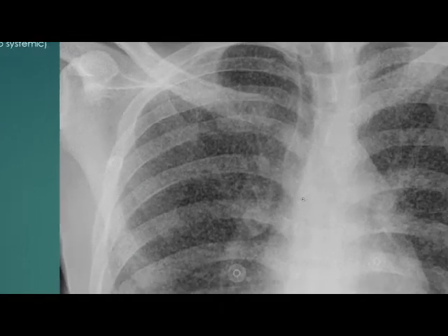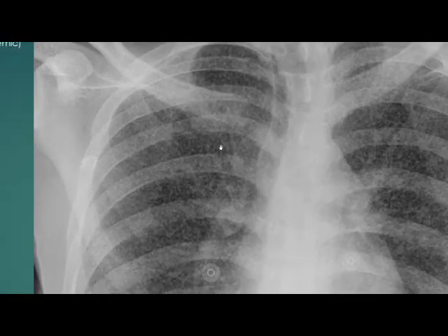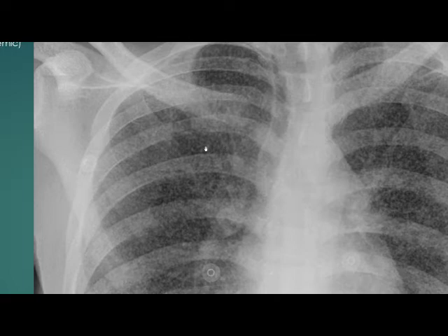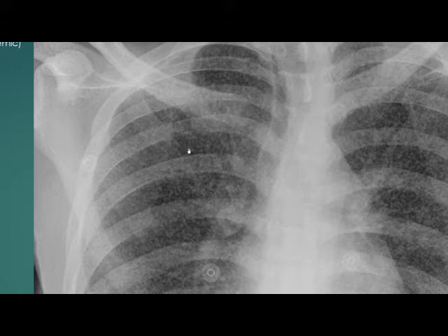Let us zoom here. The nodules are about 1 to 3 millimeters in size. They appear uniform in size and shape. There is no interstitial thickening — it's only nodules. There is no cystic change and there is no calcific foci.